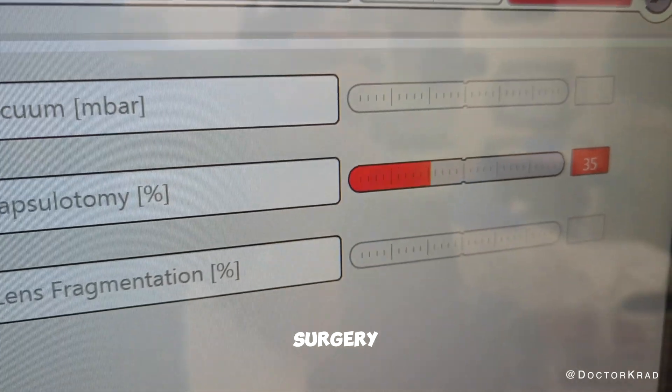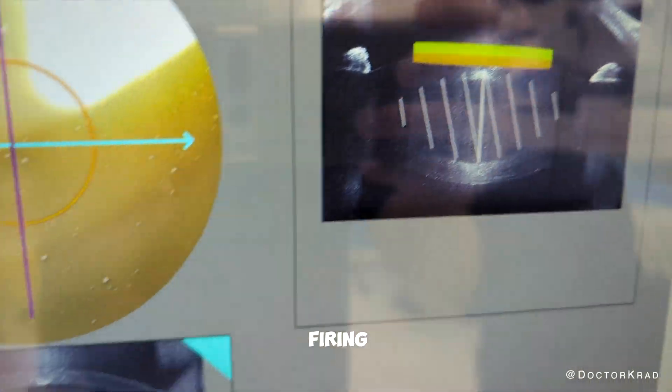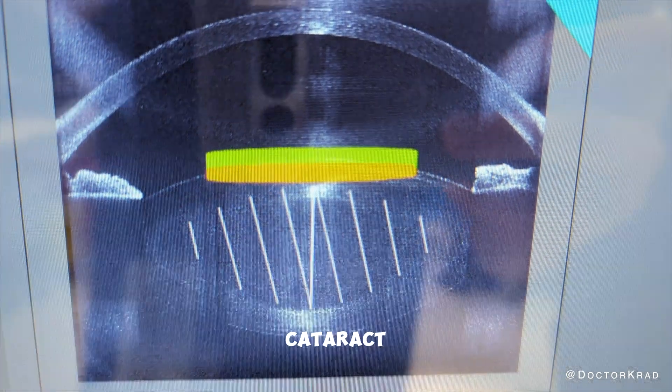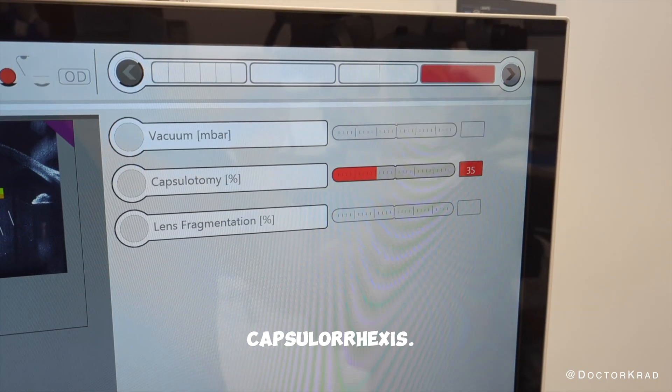During laser cataract surgery, gentle vacuum suction is applied onto the eyeball to hold it perfectly still as the laser is firing. Good suction is critical to performing safe laser cataract surgery. Here we lose suction in the middle of the most critical part of the procedure, the capsulorhexis.